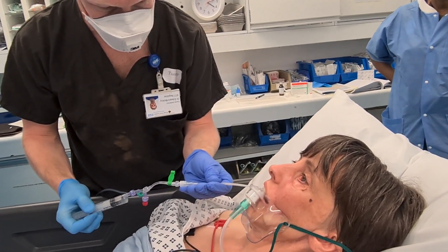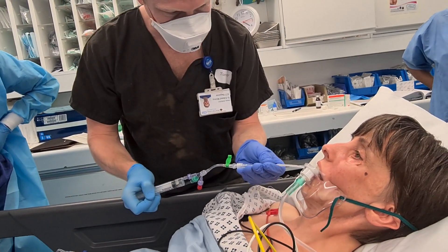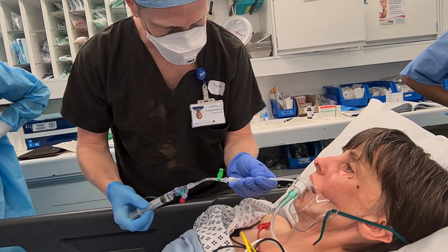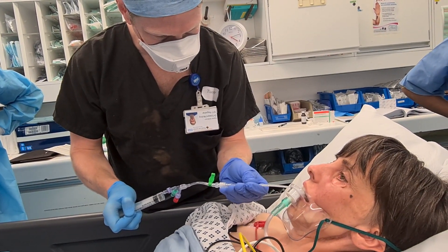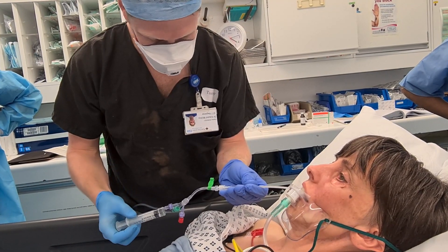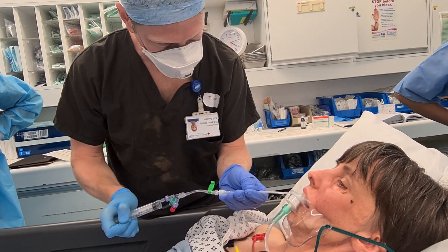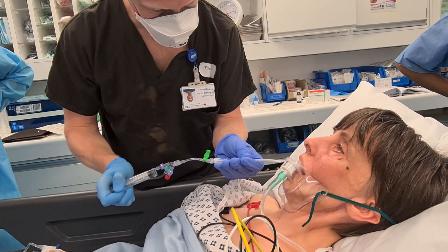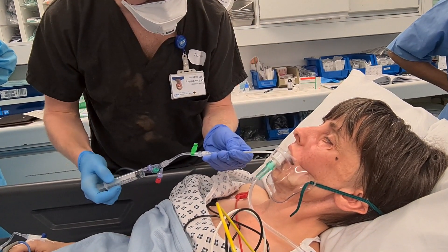And in. And out. And in. And out. Good. And out. And in. Good. And out. Good.